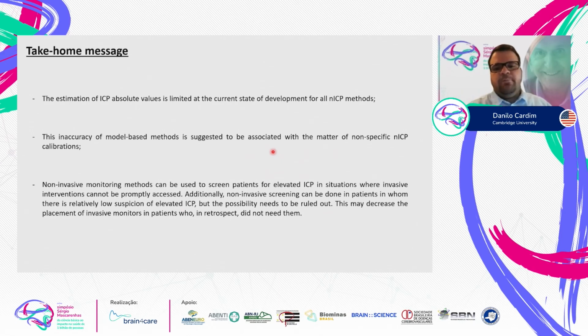So as take-home messages for studies that explored intracranial pressure measured non-invasively, as we know so far from the literature, the estimation of ICP absolute values, in millimeters of mercury or any pressure unit, is limited at the current state of development for all of the non-invasive ICP methods.